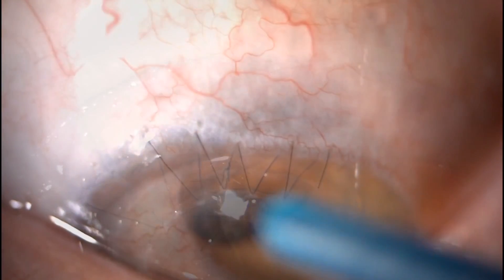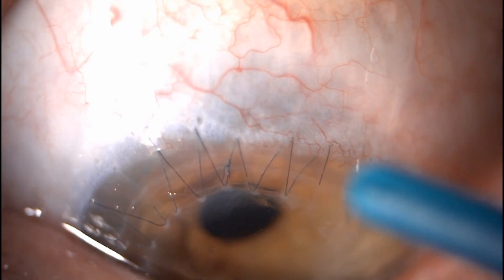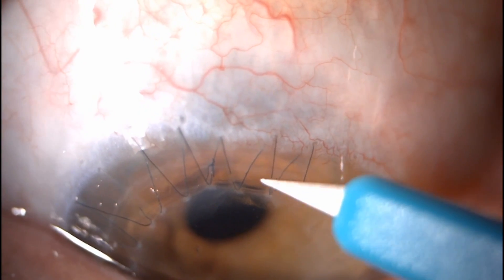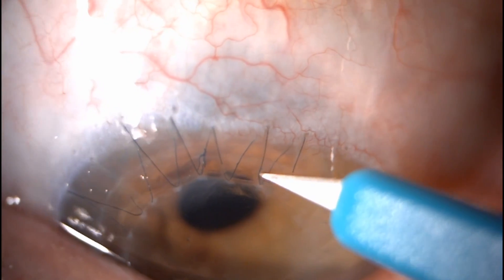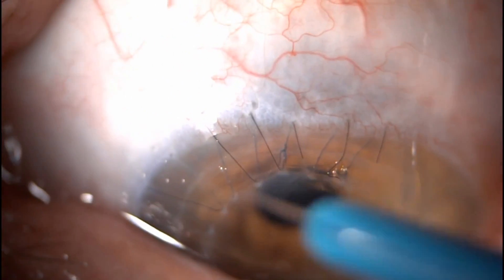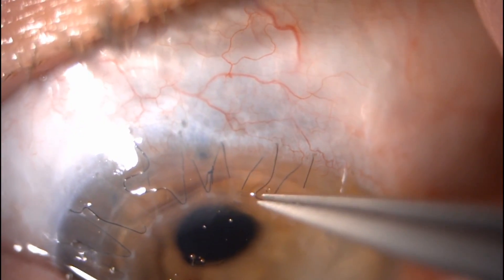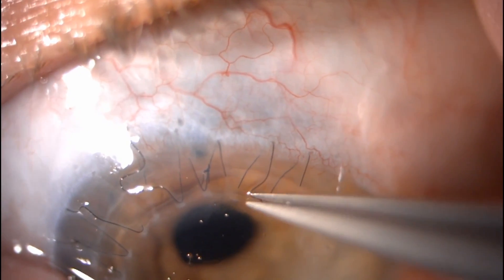Plan about 10 or 15 minutes for taking out these running sutures. I usually leave the knot, which is typically at about 12 o'clock, for last. Here you see again we've cut with the cutting blade the superficial portion of the sutures and then loosened in between. We'll do this a couple more times, then come back with our jeweler's forcep and remove that section of the suture.